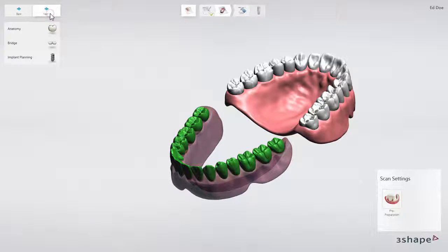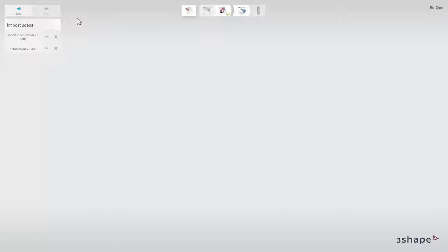Keep in mind that an Edentulous case follows a dual CT scan protocol. The Import Scan page allows you to load CBCT CT DICOM files.